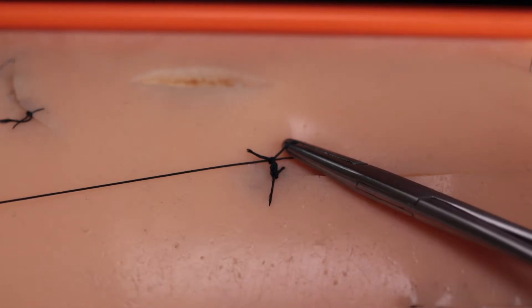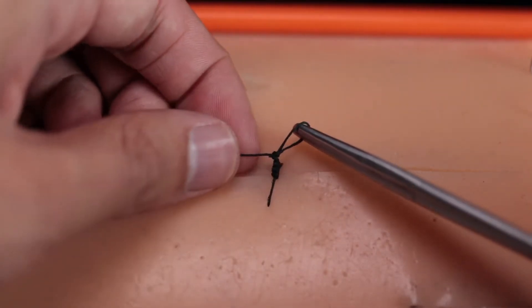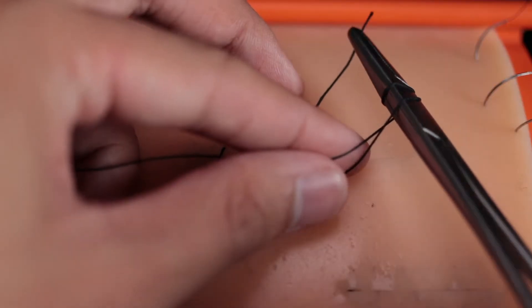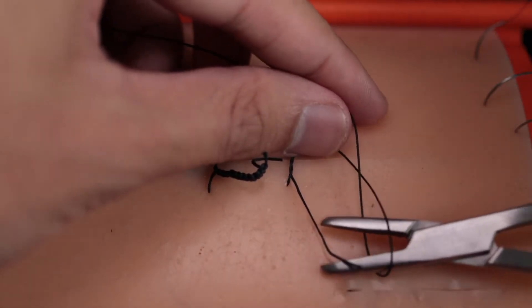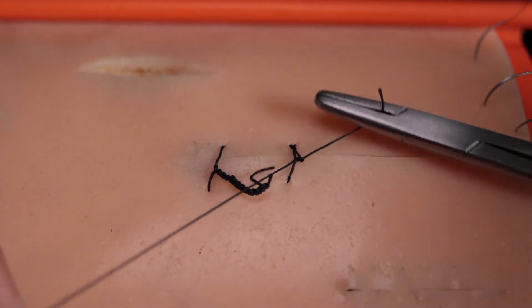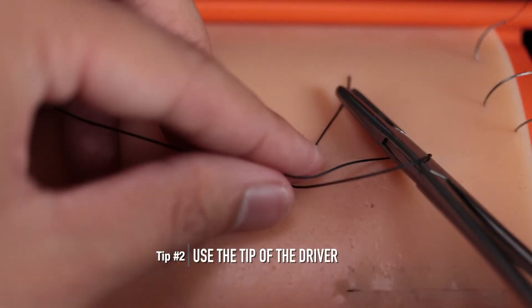If your tail was longer, it'd be a bit more cumbersome. The second tip is to use the tip of the needle driver and not the inside of the jaw. It's not that big of a deal, but you'll notice that it does slip a little bit more than if you use the end or the tip of the driver.